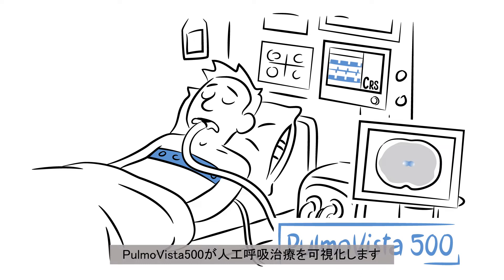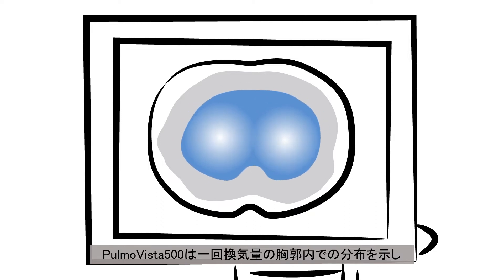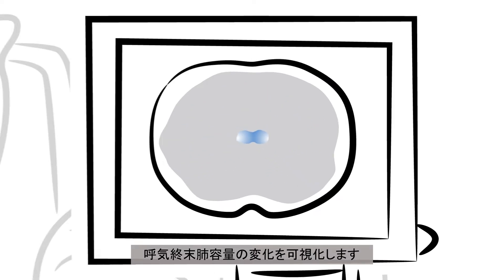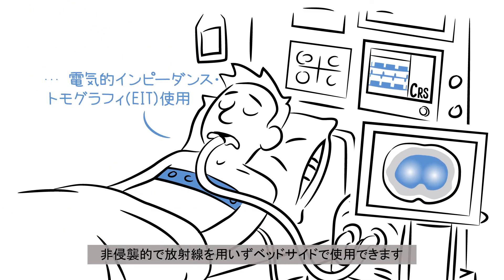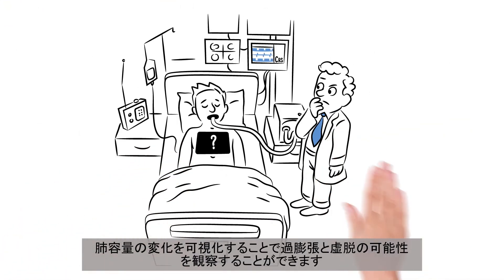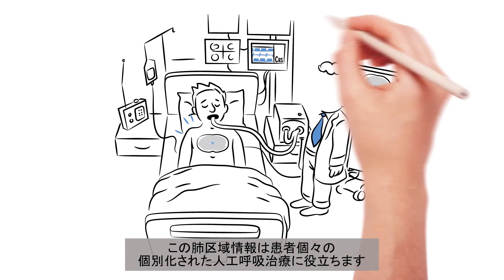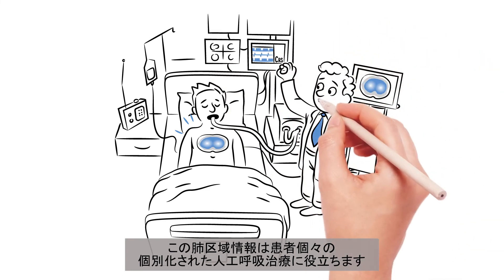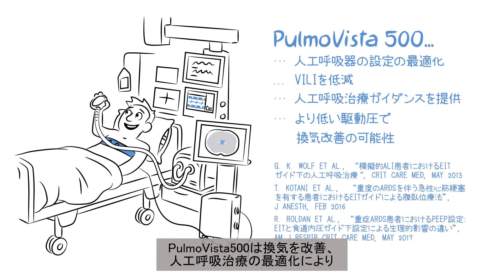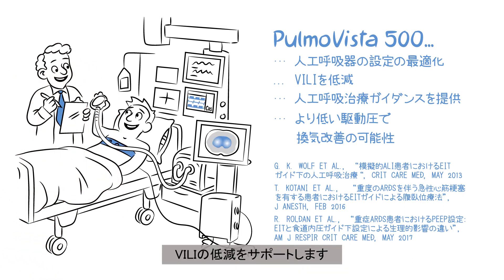Palmo Vista 500 makes ventilation visible. It shows how the tidal volume is distributed within the thorax and visualizes changes in end-expiratory lung volume. It is non-invasive, radiation-free, and can be used right at the bedside. Visualizing changes in lung volume helps to detect possible overdistension and collapse. This regional information can be used to individualize respiratory therapy.